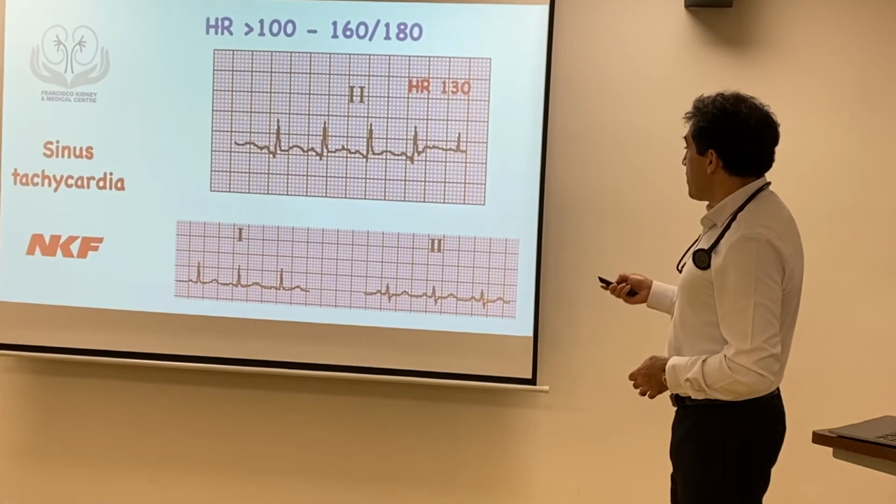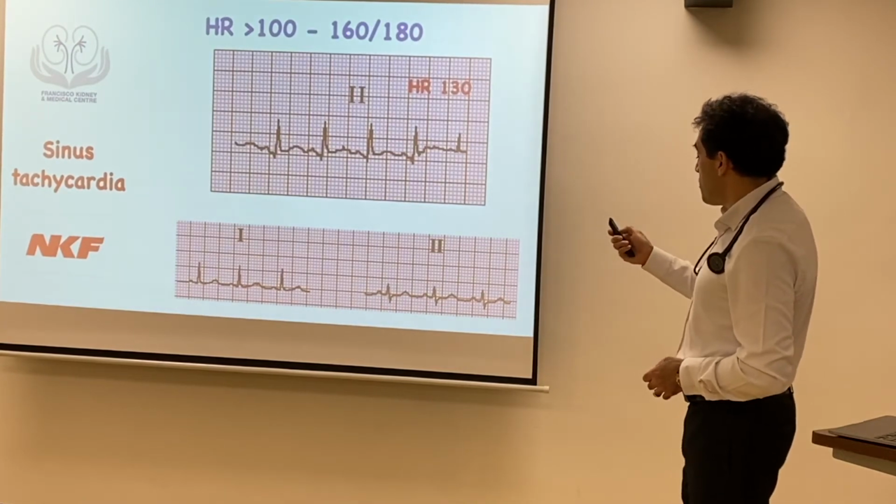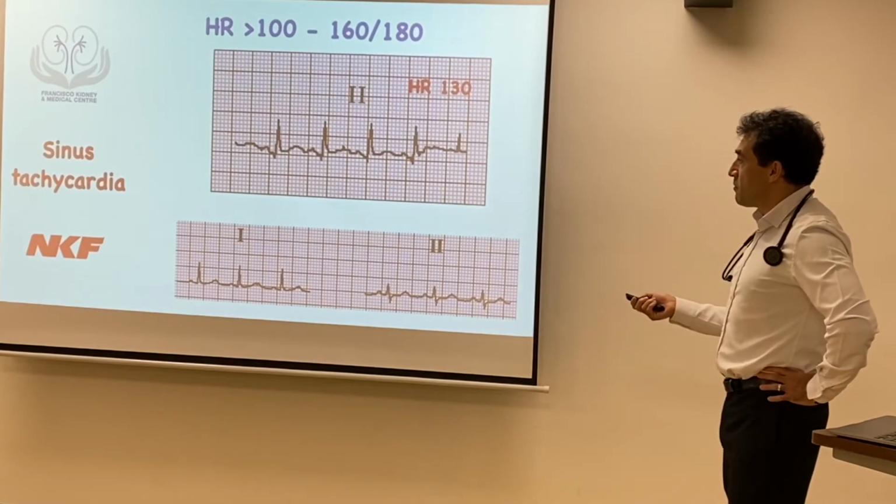This is sinus tachycardia, sinus rhythm, but faster. In this case, you apply the formula, the heart rate is 130. Just simple, yeah?